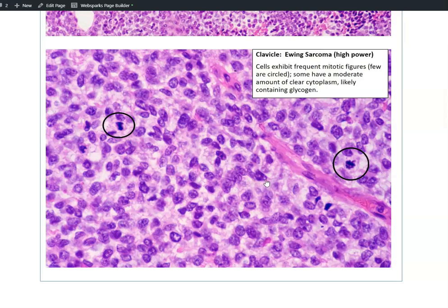When we look at the cells, we note that they have very scant cytoplasm. Some of the cells have quite pale and vacuolated cytoplasm, and this is because they contain glycogen.